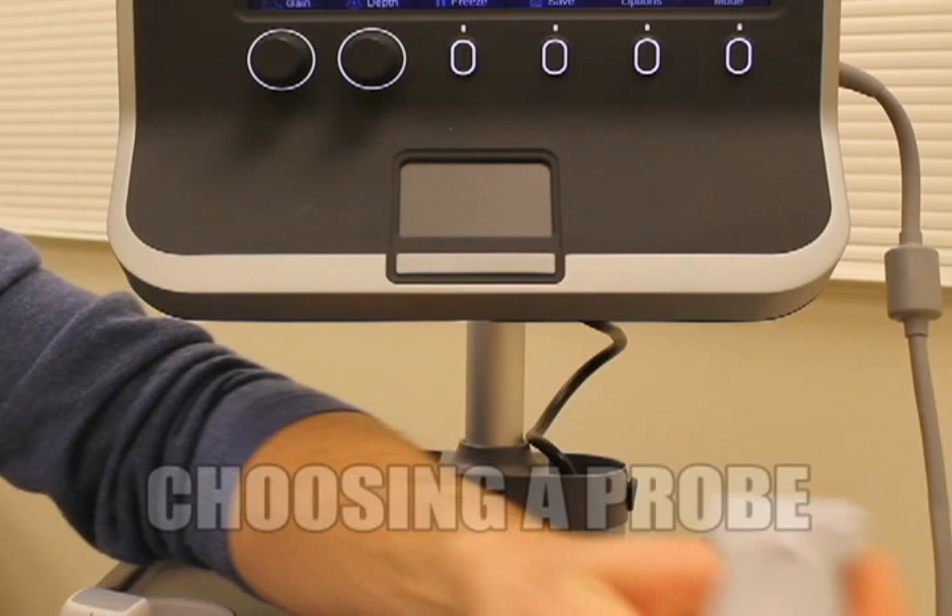Today our goal will be for you to learn how to use the ultrasound machines we have available here, which are the Sonosite Model S and the Sonosite M-Turbo. Our goal will be for you to learn how to correctly choose a probe depending on which exam you're doing, and how to use what we call knobology — the buttons available on the machines — to give you the best possible exam. Let's get started with choosing a probe.